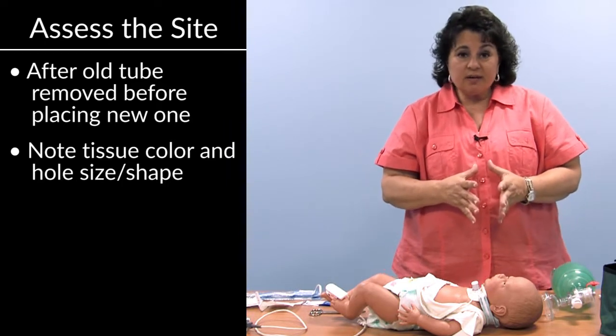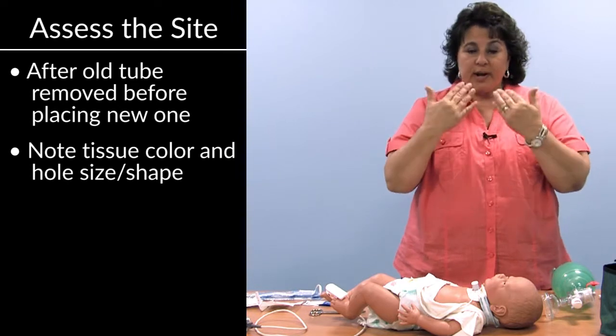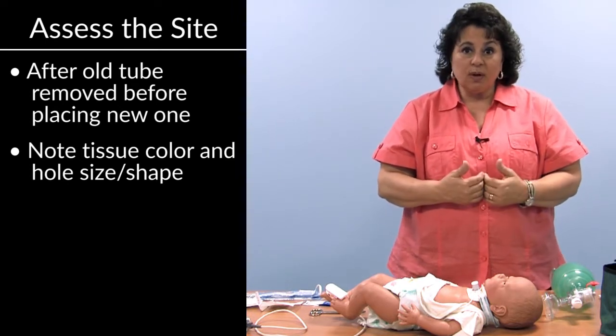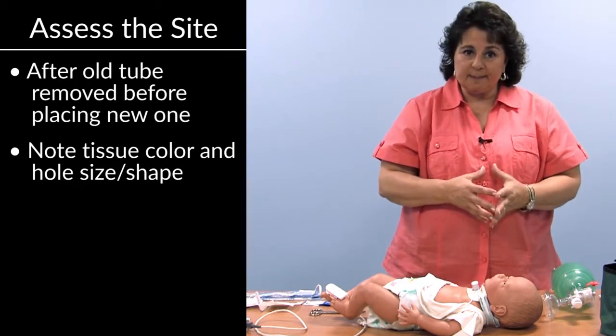If your child is not on a ventilator and can breathe comfortably through the stoma, through the upper airway, you'll have more time to assess the site. So it's individual as far as how quickly the trach needs to come out and go back in.